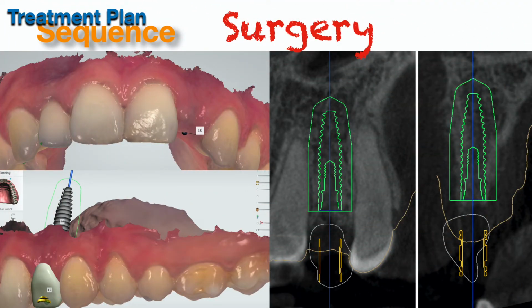So when we come back for the second round to do our implant planning, yes, we do have enough bone to be able to put the implant, but I was still concerned about the over remodeling of the bone. Well, we like to have a minimum of 2 millimeters on the buccal. If I can get a minimum of 2 millimeters, I feel good. The absolute minimum.